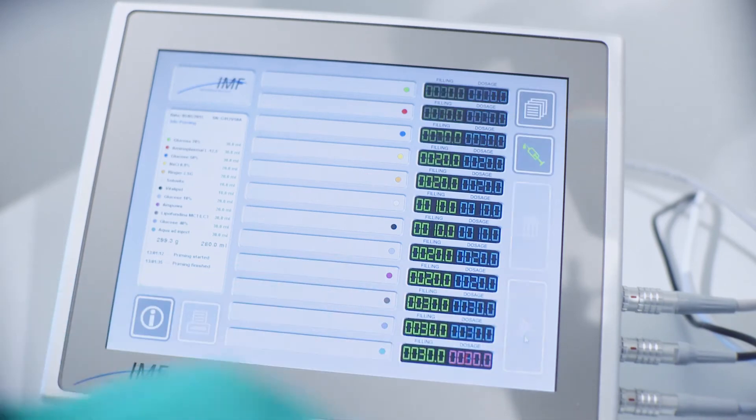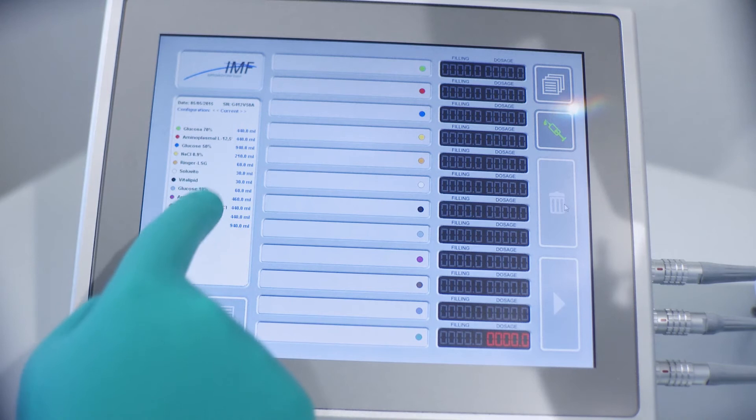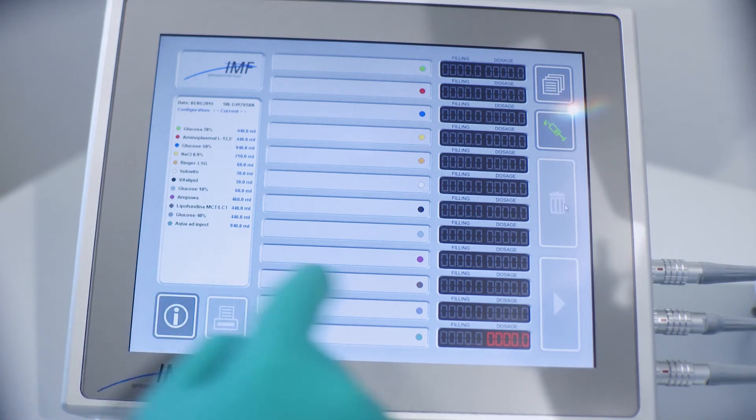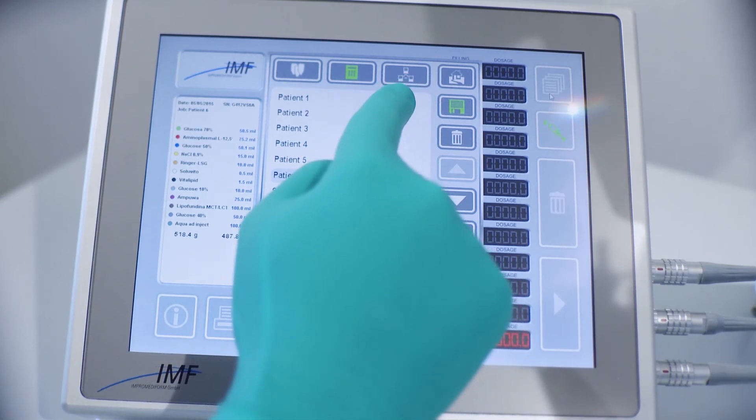Once the setup procedure is completed, the Medimix multi-compounder is ready for production. The left side of the screen will display the reminder for each ingredient. Now pressing the menu button, two new sections are available.